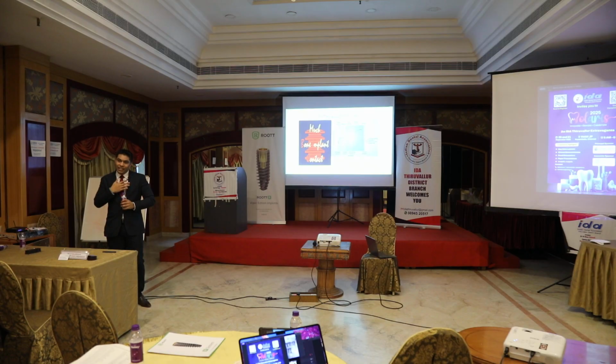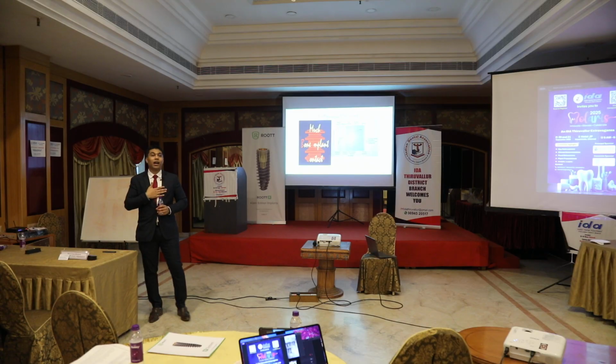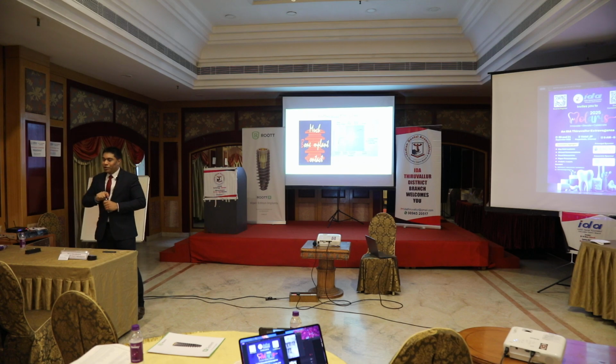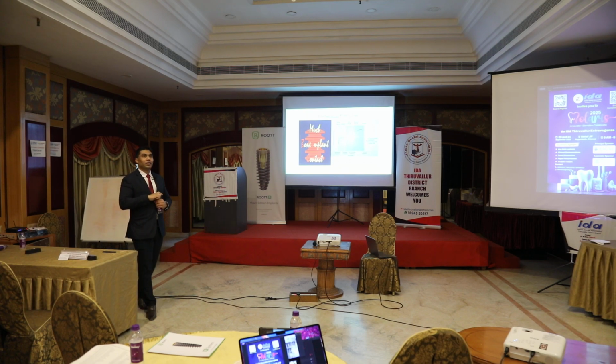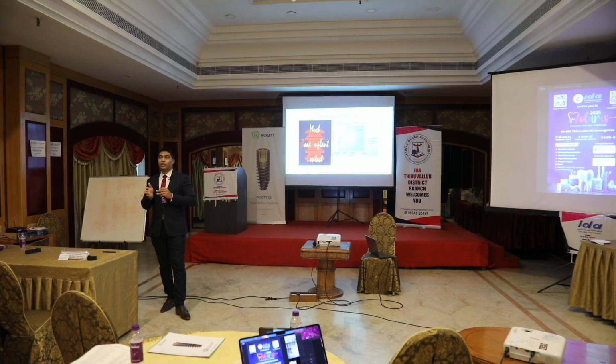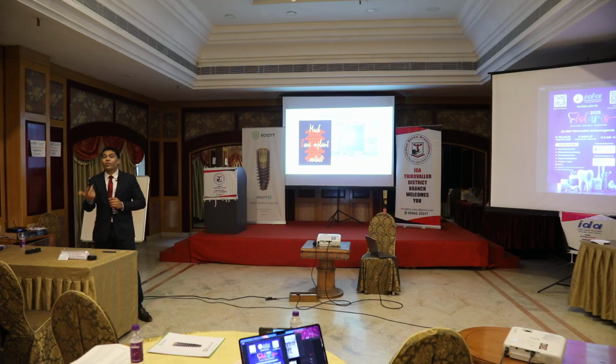These are the questions that I asked in the lectures. And maybe I was too stupid at that time, but I asked this question. There was a very good lecturer who came when I was studying, and he was telling us that when you try to place an implant, it will always shift towards the buccal side. So whenever you start the osteotomy, you should not go exactly at the center, but start a little bit lingual, because by the time you finish the drilling, it will be in the center. Why? You have to ask this question, why?